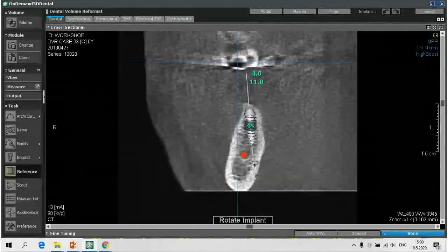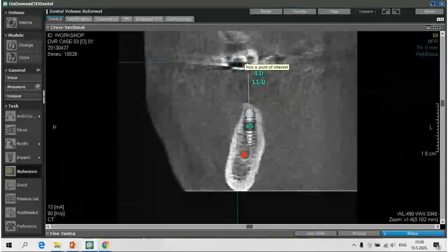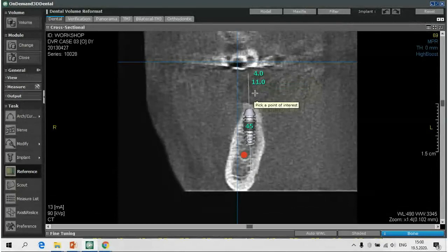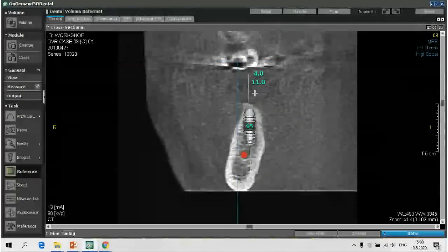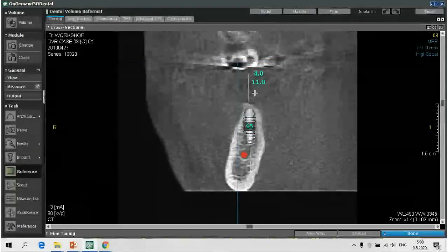Probably at the beginning after the prosthetic reconstruction, because the whole construction will be thicker on the lingual part, he will have a little bit of discomfort and a slightly changed appearance on the buccal side. But if all other parts of the procedure are done correctly, he will probably have a long-lasting restoration.